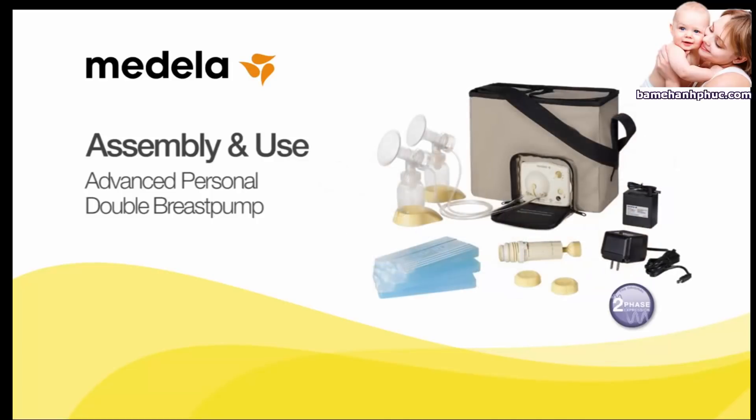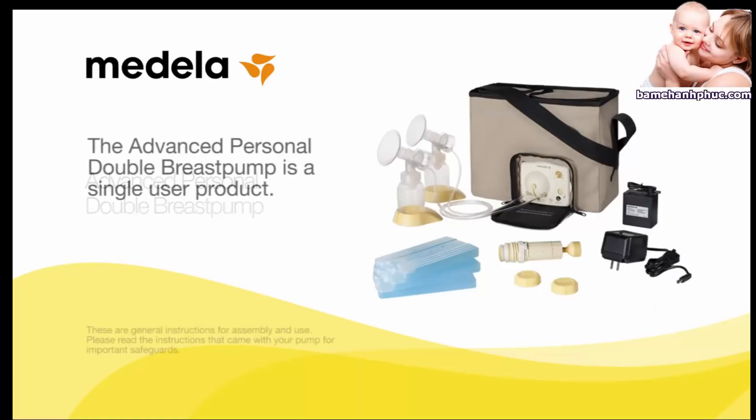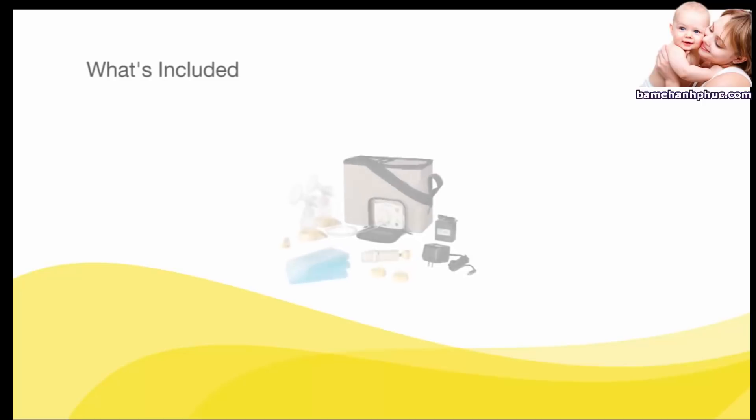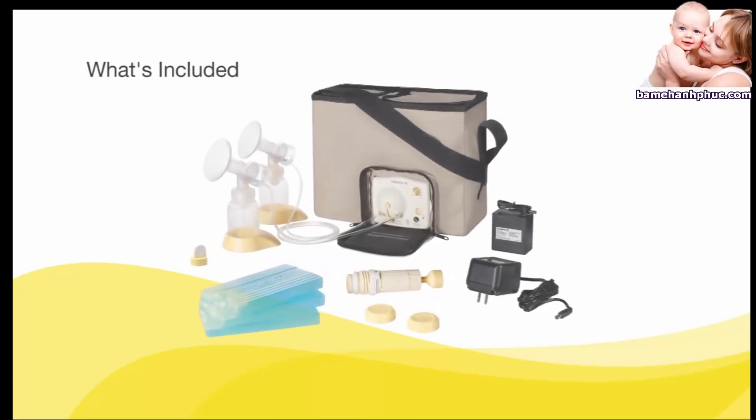The Medela Advanced Personal Double Breast Pump includes everything you need to pump, all in a convenient shoulder bag. The Advanced Personal Double Breast Pump is a single-user product. Use by more than one person may pose a health risk, raises performance questions, and voids the warranty. Before you begin, identify all the parts you will need for assembly.